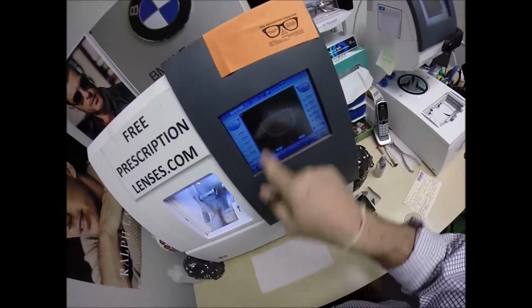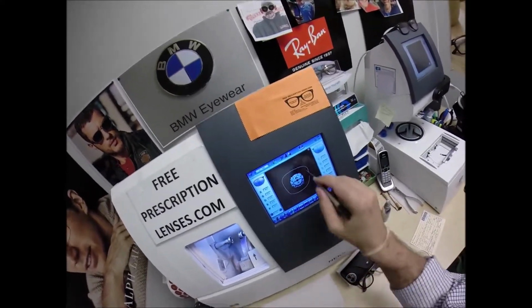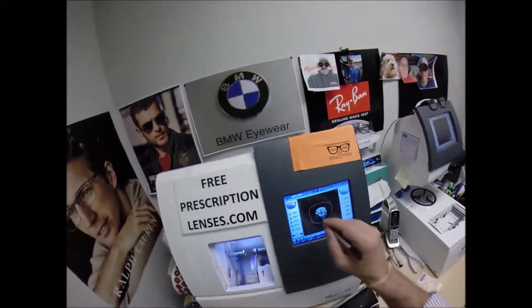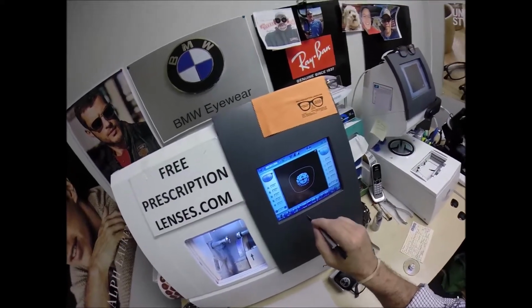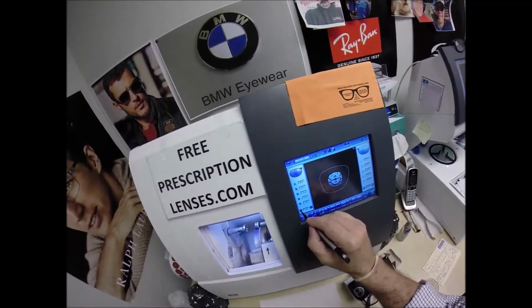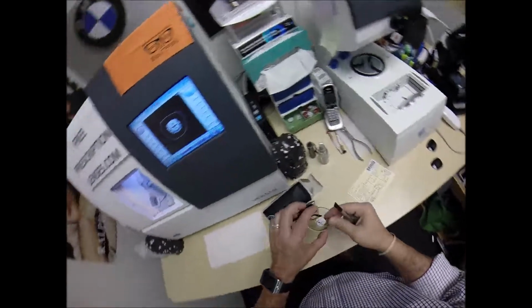But I will wake up the computer. We're going to get rid of that Oakley shape that was so difficult to cut. Bye. Now let's welcome. Hello, RayBan 2140 Original Wayfarer. This is job number 1631. These are polycarbonate lenses. If they were plastic, high index plastic, or Trivex, I would select that, but we're going to stick with that.